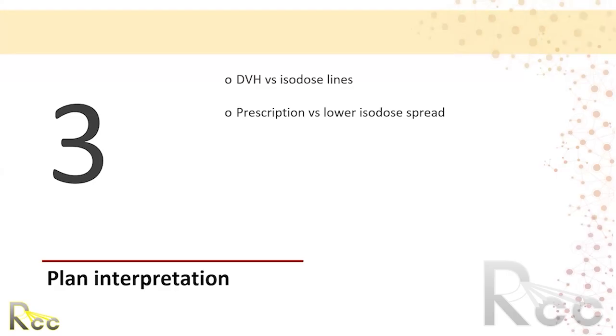If you can give us more details. So the important part is our criteria: 95% of the dose should be received by 100% of the volume. Sorry, 95% of the dose should be received by 95% of the volume, or 100% of the volume, actually. Got it. And secondly, the last 50% isodose line, where it's touching, where it's going.